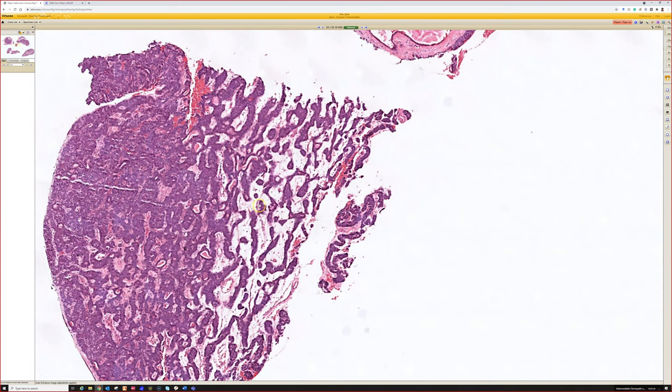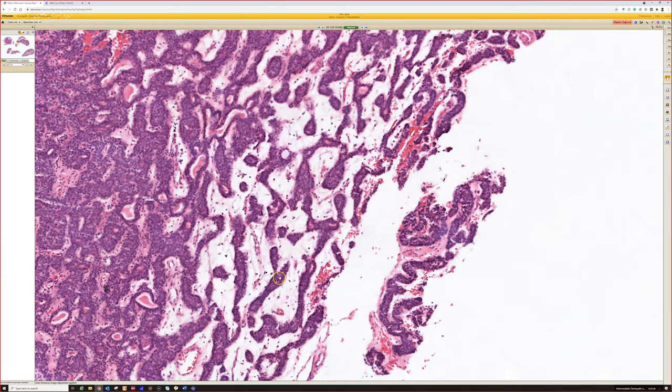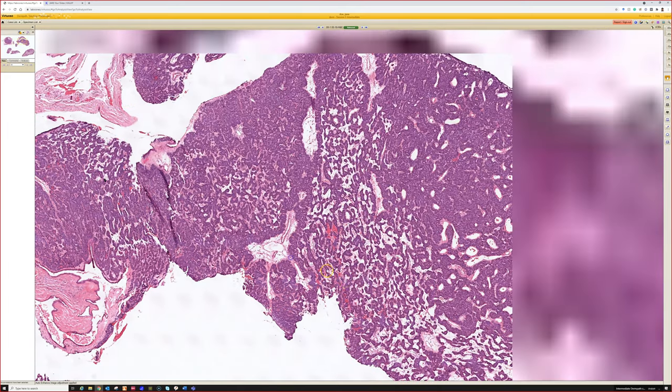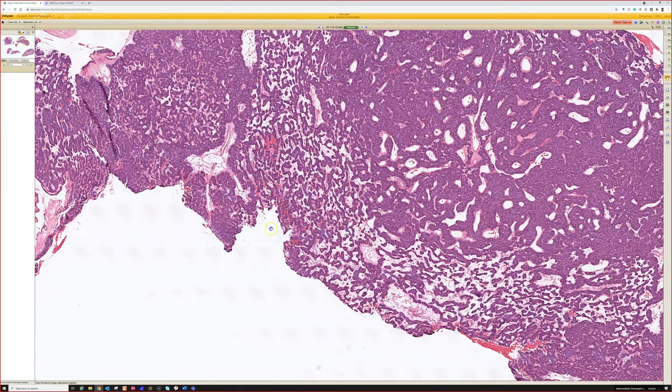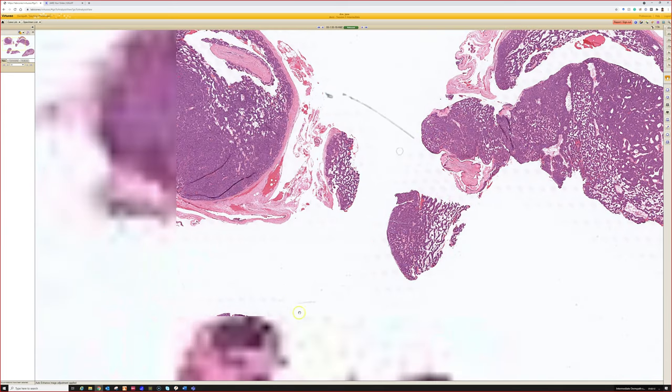The other thing I will point out is that sometimes you can get abundant edema in the background of spiradenoma, and so it can give you these very stringy, elongated strands of tumor floating in a myxoid background. And if you have just a chunk of this, it can look really weird and not make you think of spiradenoma at first because you're usually used to seeing a big blue solid nodule. But just know that this is a common finding to have a lot of edema. And if it's really dramatic or you only have a partial biopsy, sometimes that can be a confusing feature. If you just got a fragment of this, for example, it might be a little harder to sort out. But usually when you have the whole thing, you can see some other areas that look more classic for spiradenoma.